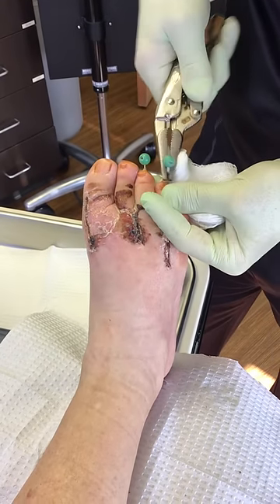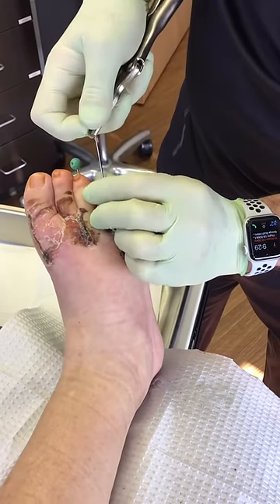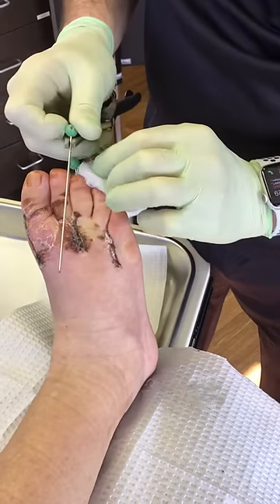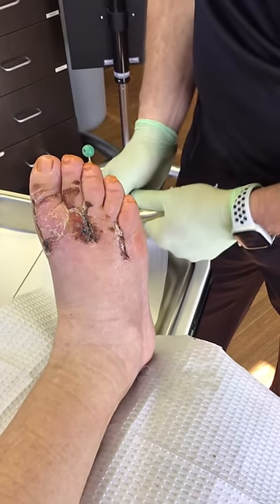Let's do this one. A little bit of pressure. A little bit of pressure here. There's two. One more to go.